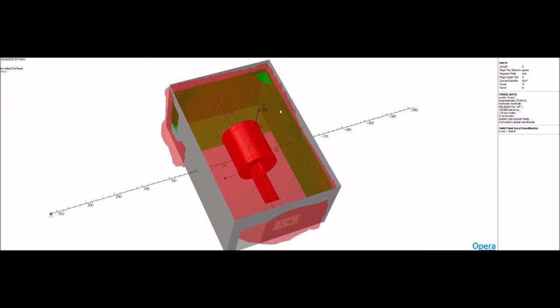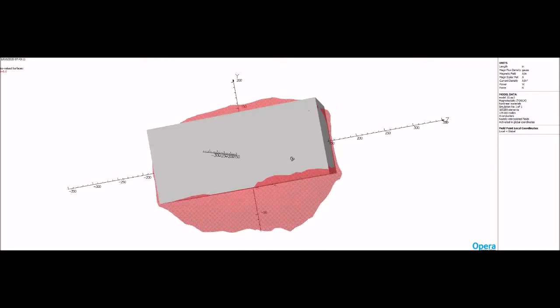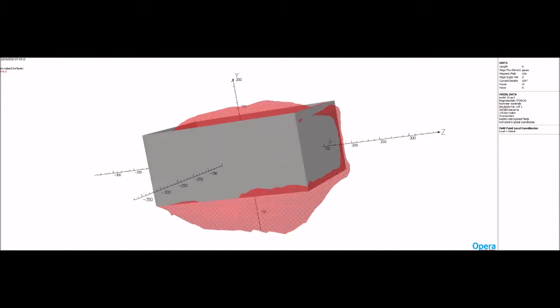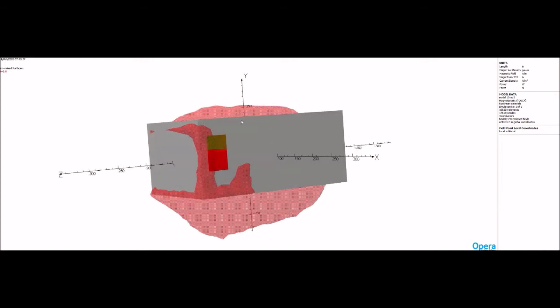Now with the addition of steel on the sidewall here, you'll see that the 5 Gauss line is eliminated from leaking out of the sidewall. Most of the back wall is now clear. However, because there's no steel over here, it's leaking out along this side here. So we're going to have to add some steel right here to prevent that.